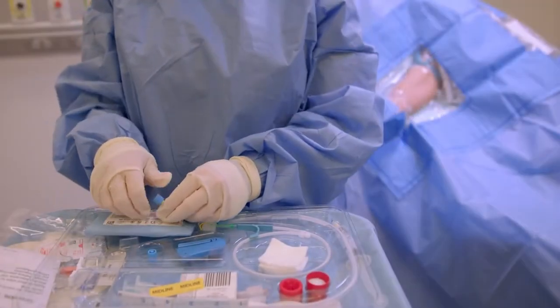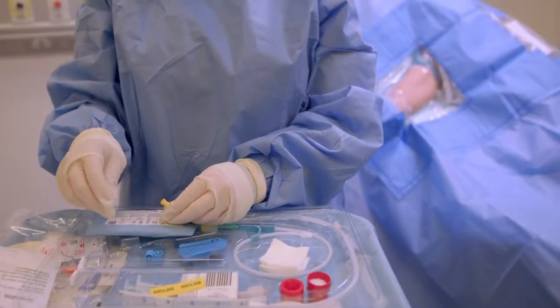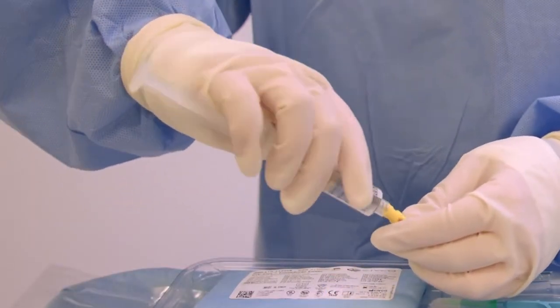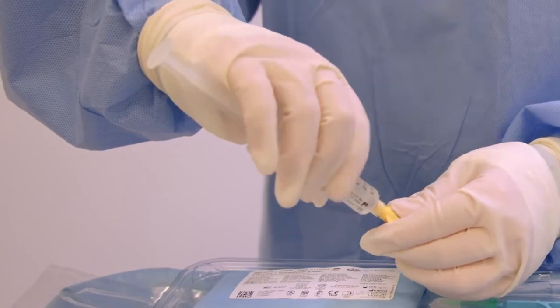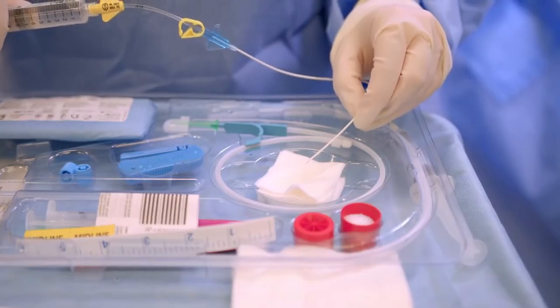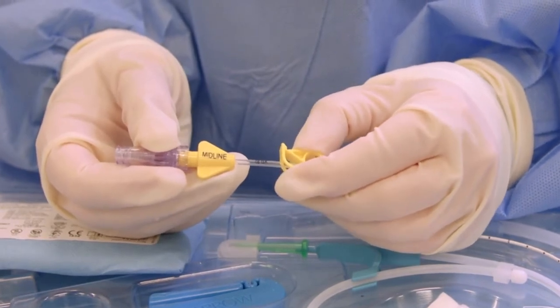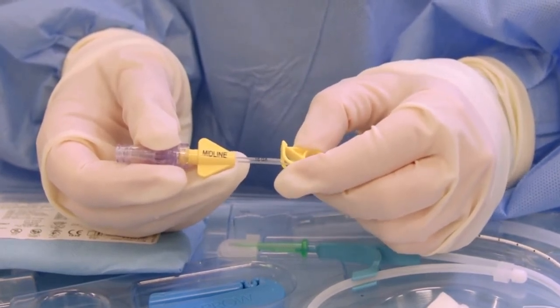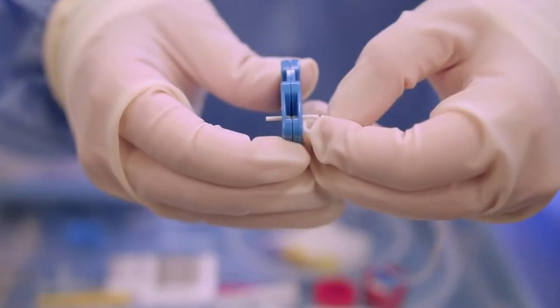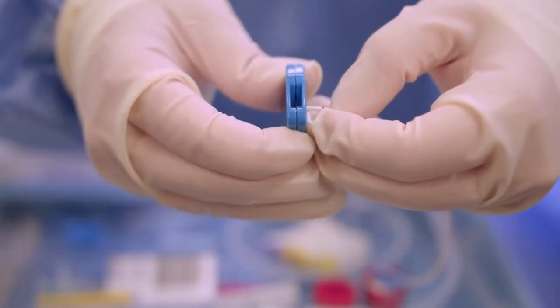Prime the catheter or lumens with sterile, normal saline for injection. Remove the end cap from the catheter lumen. Flush each lumen with sterile, normal saline for injection to establish patency and prime lumens. Clamp or attach luer lock connectors to extension lines to contain saline within lumens. Clamping protocol will depend on type of needleless connector used in your facility. If needed, trim catheter using arrow to the appropriate length.